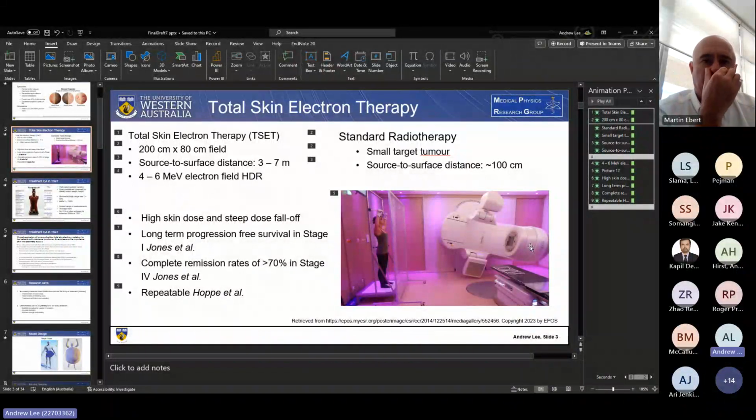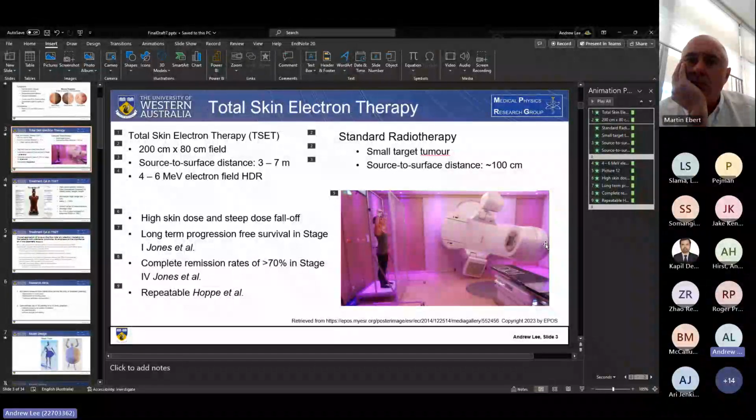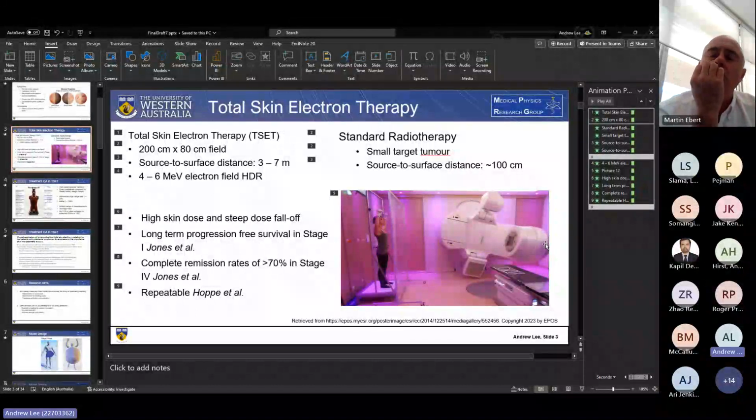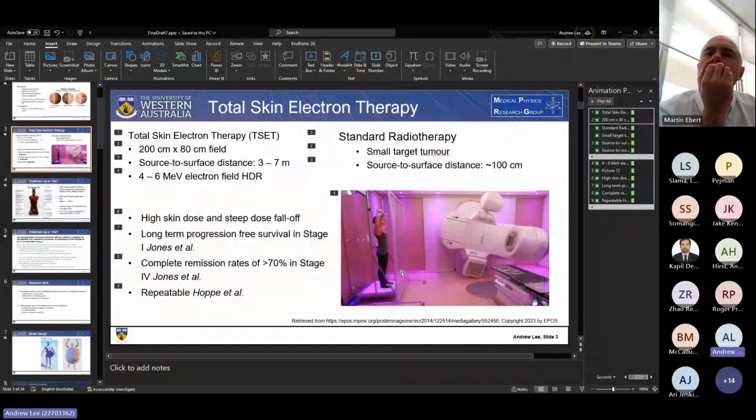And so while we have a dual field, which is created by a gantry angle below the horizon and slightly above the horizon, this can still create hotspots, and that low uniformity of the field is hard to apply to the actual patient. So to solve this, typical methods have been using a scattering foil, which is placed in front of the beam, or this beam spoiler here.